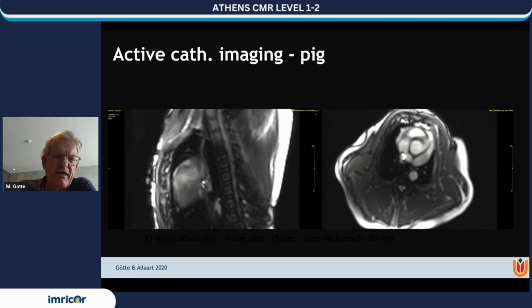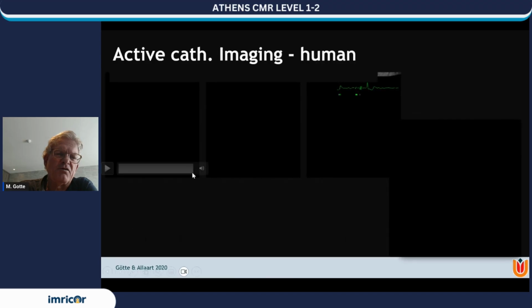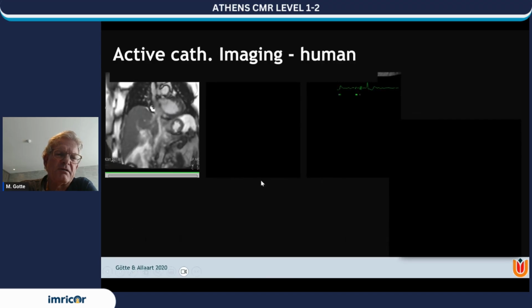So you have to be prepared to provide him or her the next image. So it's quite challenging, and we practiced this multiple times before we did the first ablation, the flutter ablation, also in 2020 in a patient.